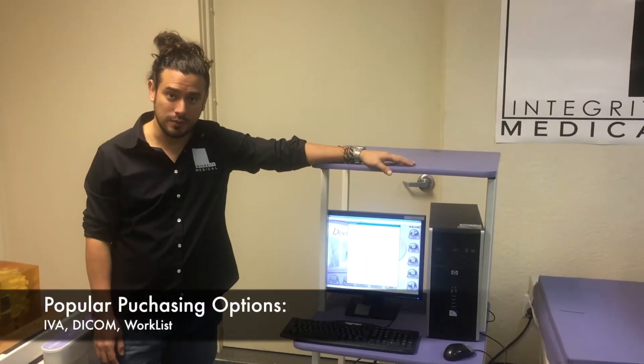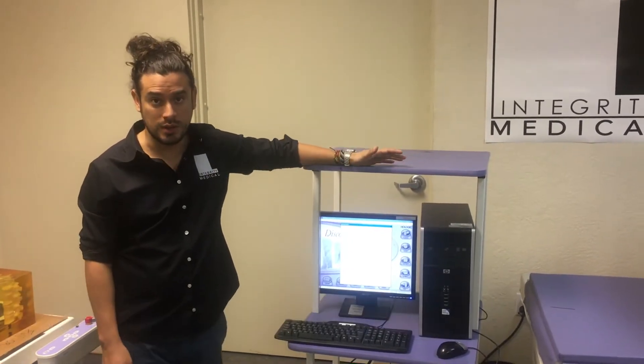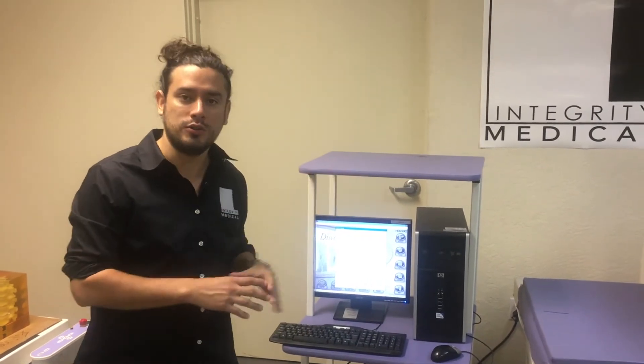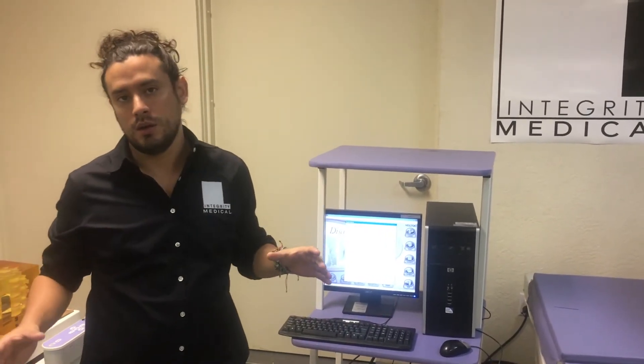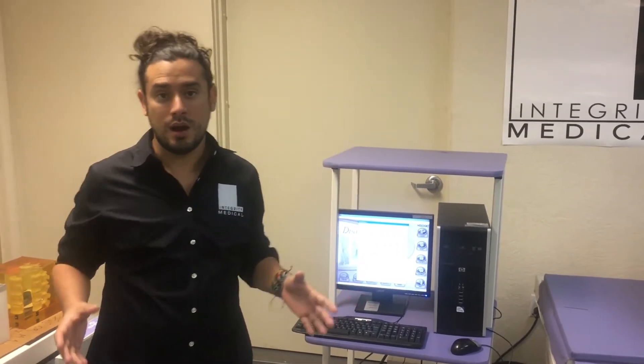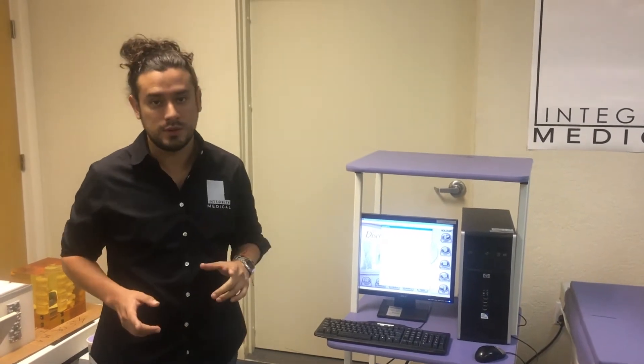One of the very popular options is IVA, which stands for instant vertebral assessment. It's basically a view of a whole spine, and it could be an AP view or a lateral view. That option is available for purchase with Discovery C — it's not one of the standard options.